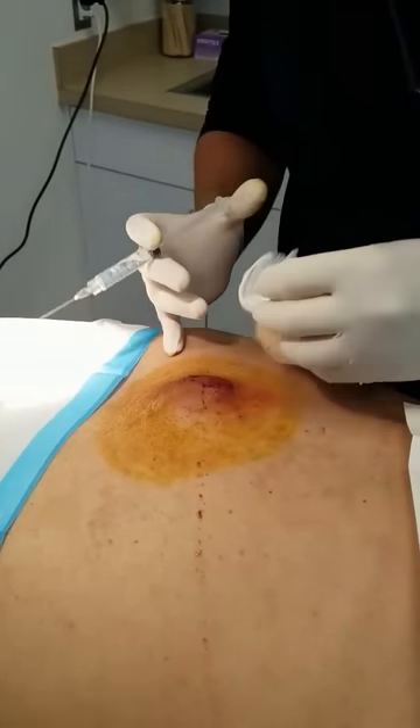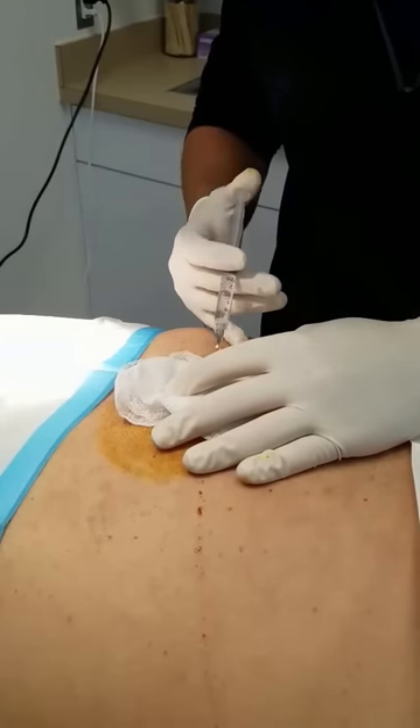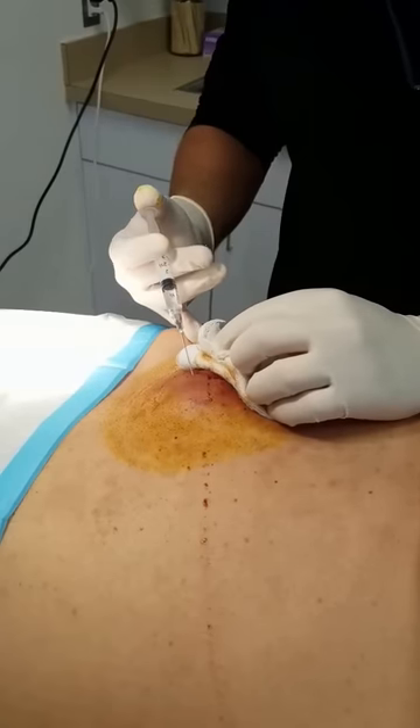It's going to be a little bit of a poke or burn, okay? A little poke, a little burn. You okay? Yep. I feel a little burn though. I'm sorry. I didn't feel it.